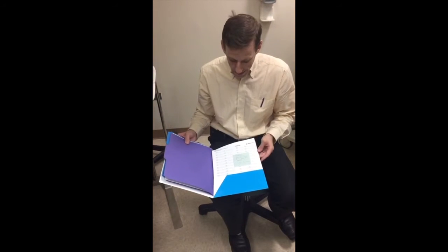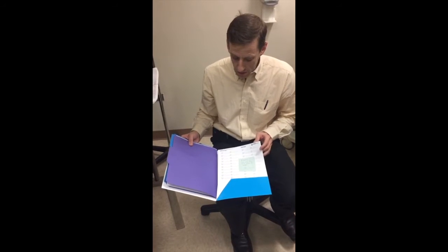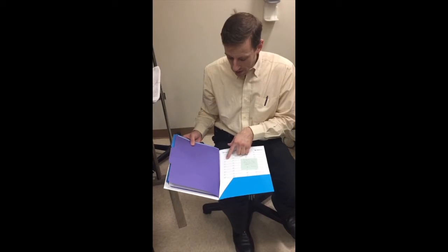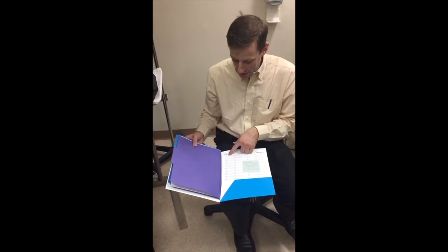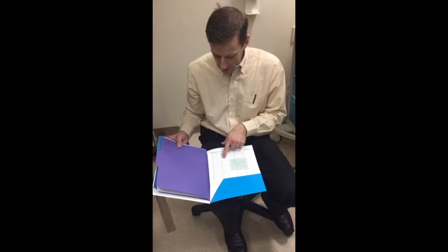There are labeled stickers. For any one patient on any one day, you label three stickers with the name, the date, the date of birth, and the time.